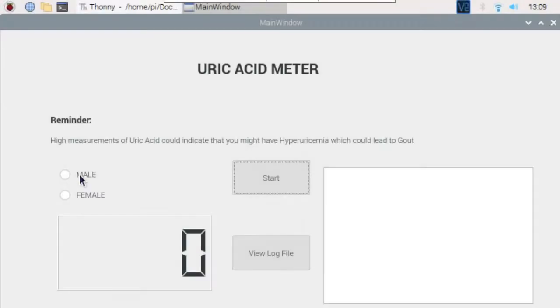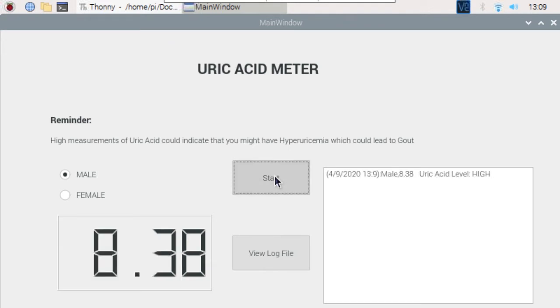First we have to select the gender. This will be used to classify if your measurement is low, normal, or high. Next we will click the start button.